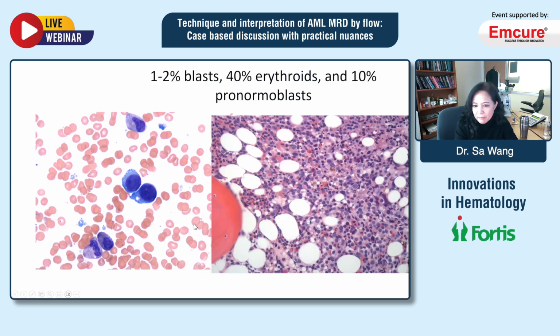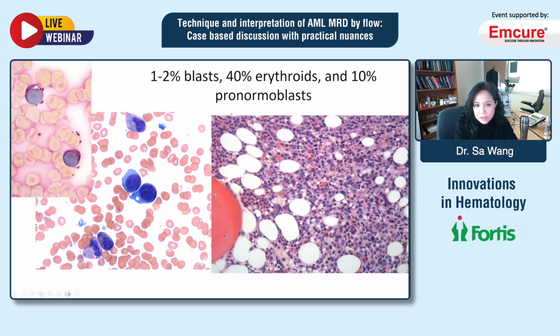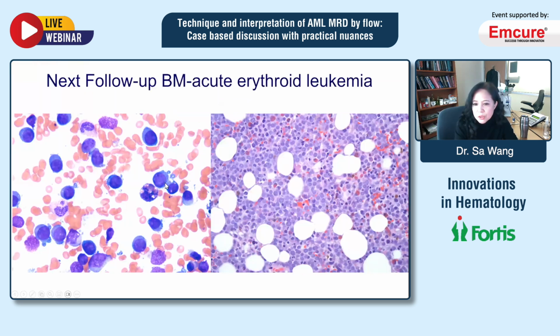In every case we have morphology, and you start to see this very immature erythroid, almost blast-like, pronormoblasts, but very abnormal ones. If you look at the biopsy, you start to see these cells, right? So in this case, even though we only have 1 to 2% of blasts, we did have 10% of pronormoblasts by counting. This is the PAS to show you these abnormal erythroid precursors. We waited a little bit, and the next biopsy showed acute erythroid leukemia.